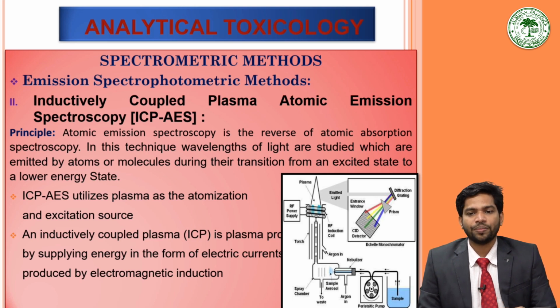That is, in atomic absorption spectroscopy, an incident light falls on the sample, and its molecules absorb some wavelengths. Analysis of the emitted light by the detector reveals their nature. However, in atomic emission spectroscopy, molecules within the sample fall to a lower state. They emit light which is analyzed to reveal their nature.